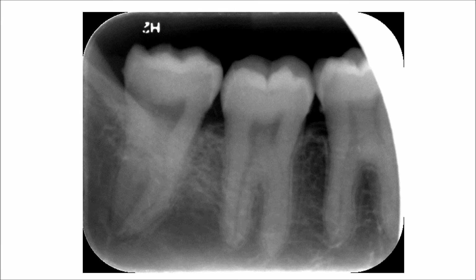Another radiograph that shows different calculus depositions is a periapical radiograph, which also plays a part in detecting calculus in the oral cavity, especially in initial stages. They can also be detected by passing a probe along the mesial and distal surfaces of the teeth below the contact points. In this periapical radiograph, you can see calculus deposits showing the typical triangular projection on the distal surface of the third molar, the mesial surface of the second molar, and the distal surface of the first molar.